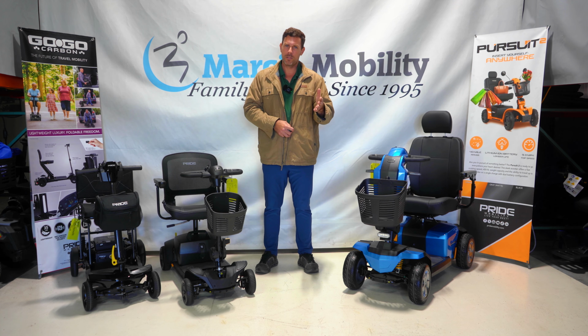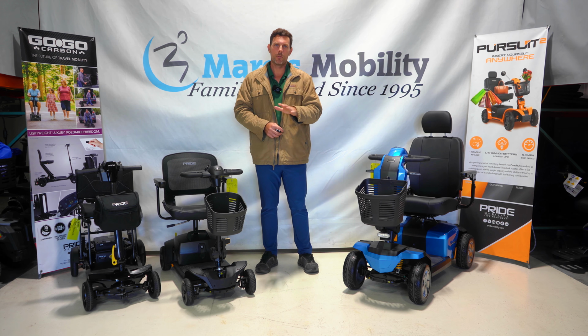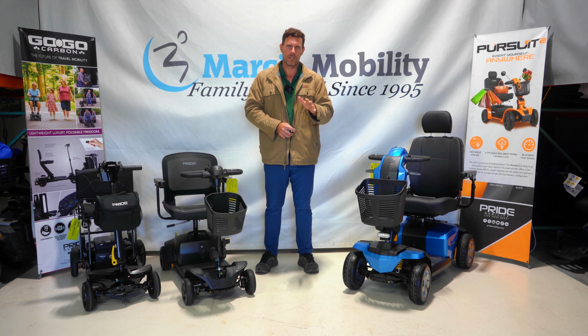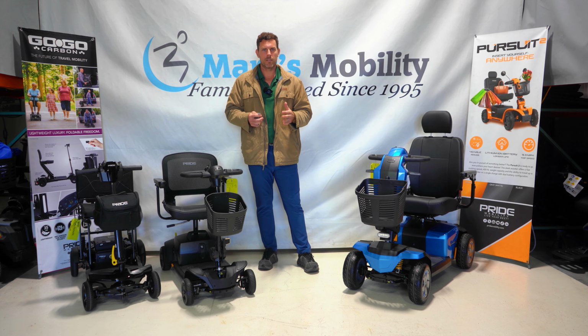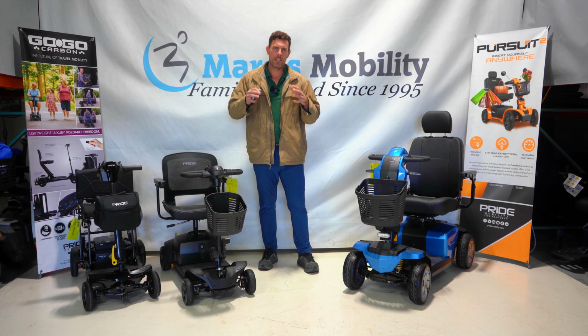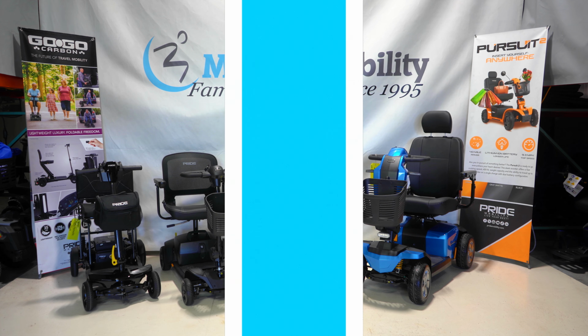So once you get one of those cheaper items off of Amazon, do know that once that thing fails on you, you're not going to be able to get replacement parts. You're going to have to purchase another scooter. Unlike the Prides, the Goldens, and the other major brands on the market that are typically higher quality and have plenty of service and parts here in the United States.